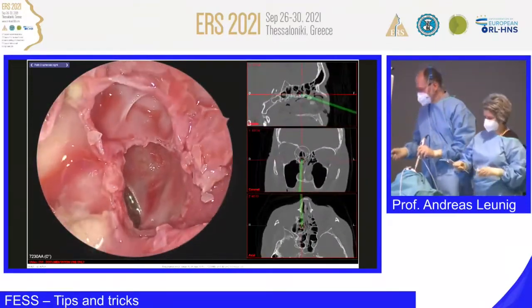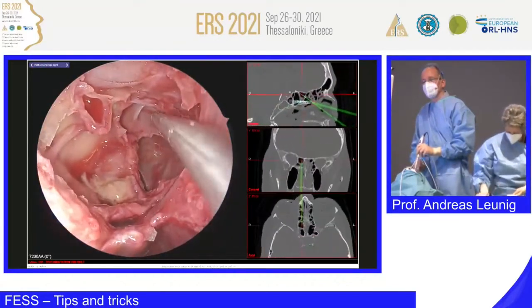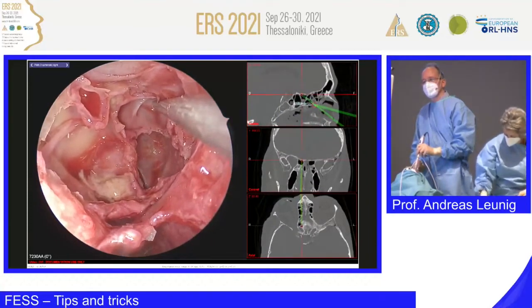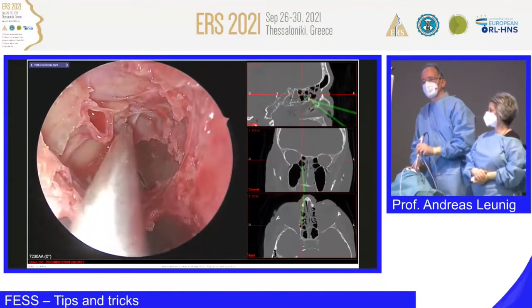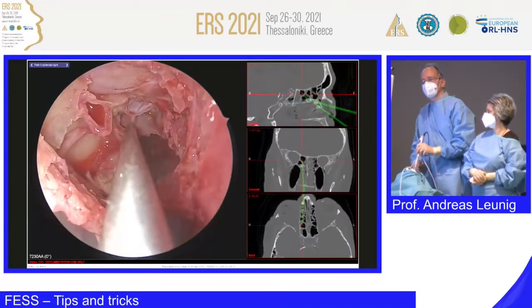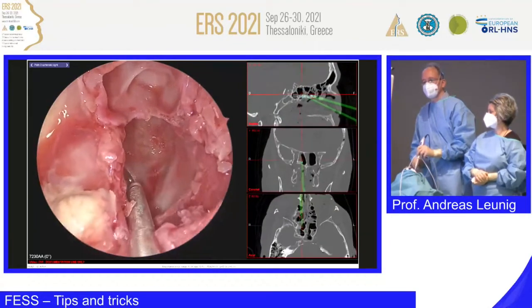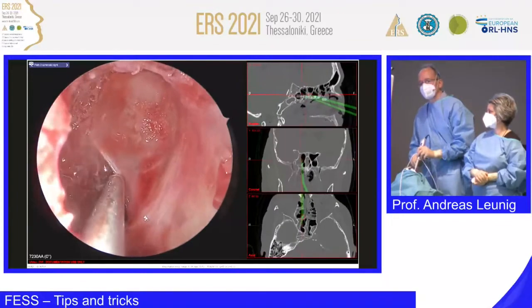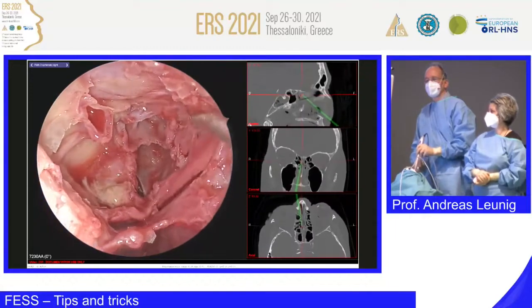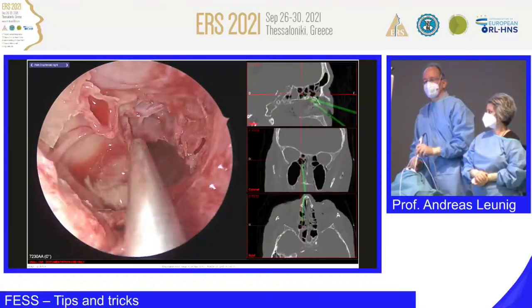So we are looking inside. Are we already there at the skull base? What do you think? Can you see it? Yes, we are touching the anterior skull base in the posterior ethmoid. There are tiny bony lamellas. We are really in the last corner. Now we are going in here. This is the sphenoid sinus, and there's some septation. Pay attention to the septation. Don't go there, don't fracture. Maybe you can injure the internal carotid artery and cause a big problem.